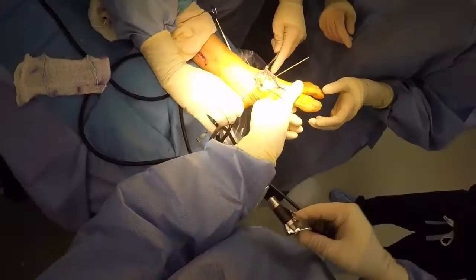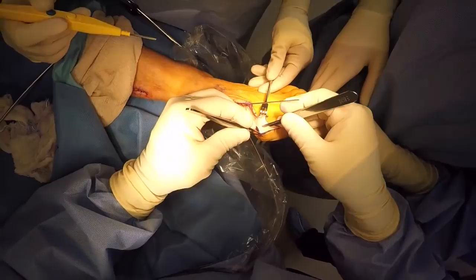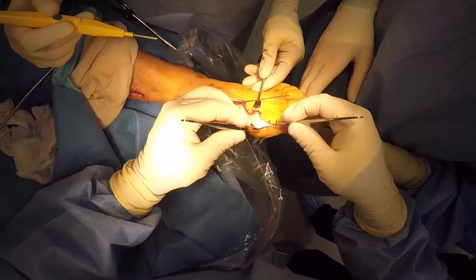This layer, that's right here. So what you want to do, you can just make a small little bit right here and then be able to pull this up, and then sweep underneath it to just get the stuff out of the way. I'll let you do this on the other side. So sweep your neurovascular, stay under.